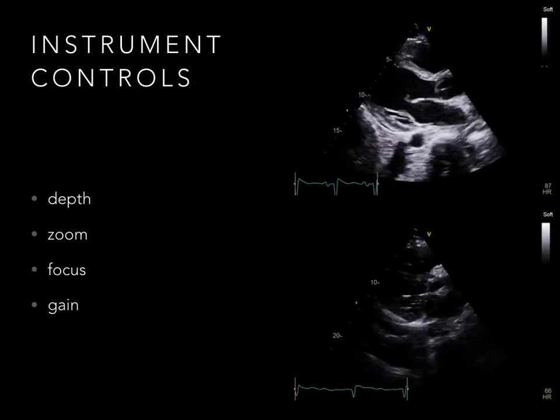The returning amplitude of the ultrasound signals is very small, so to produce an adequate image, these signals must be amplified. Gain control does this by affecting brightness of the display. When gain is set optimally, blood-filled chambers are echo-free.